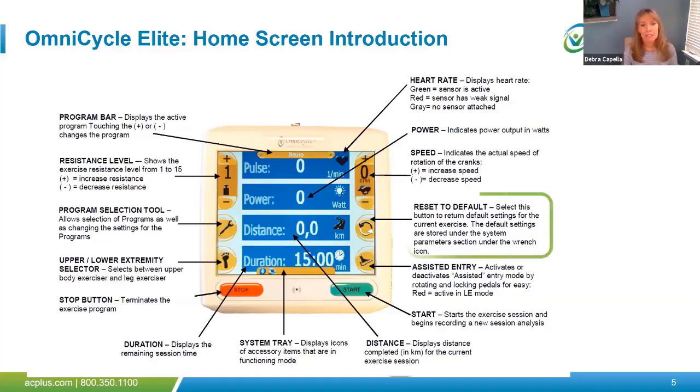We also have the ability to press this reset to default. The unit is going to be set up with a lot of defaults, maybe it's a 15-minute duration, maybe certain settings. Sometimes somebody will customize it, and the next therapist coming to work with their patient wants to reset it so that it's back to the regular manufacturer's defaults. You just have to press that little portion of the screen and it will reset to default.